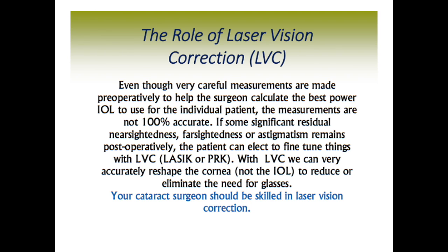What about the role of laser vision correction, like LASIK or PRK, at the time of cataract surgery, or actually usually somewhat after the cataract surgery is done? Let's say that even though very careful measurements are made preoperatively, as we discussed, to help the surgeon calculate the best power intraocular lens to use for the individual patient, the measurements are not 100% accurate. We have the most state-of-the-art instruments to do those measurements, and they're very accurate, but not 100%.